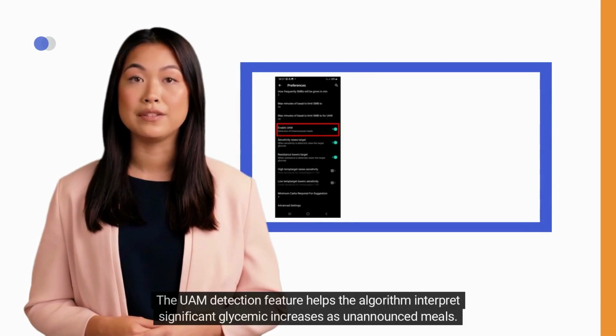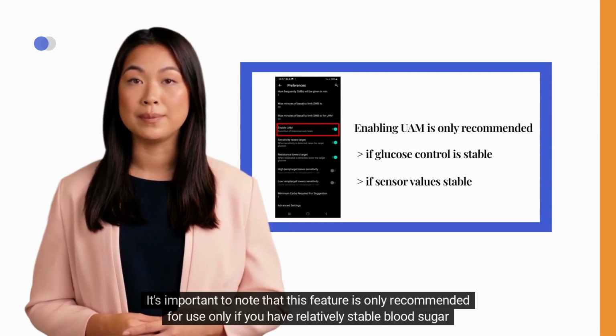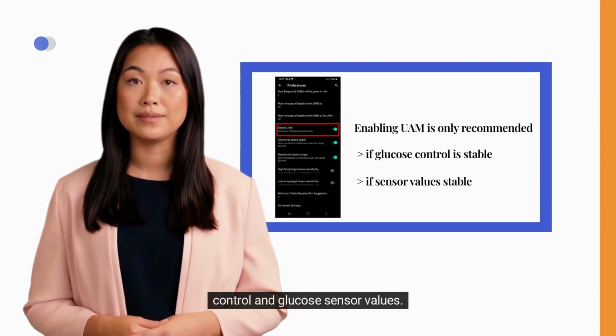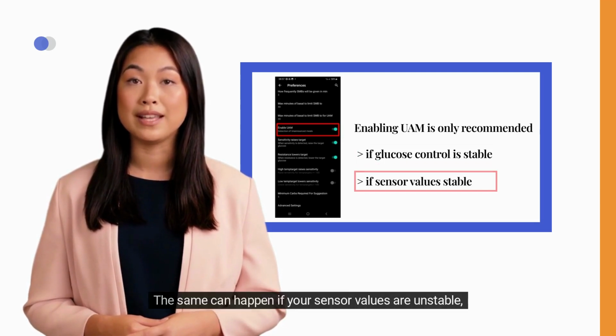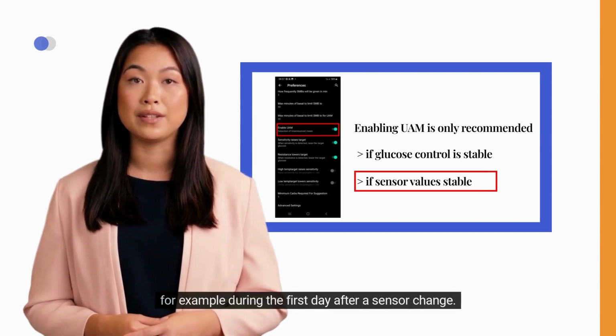The UAM detection feature helps the algorithm interpret significant glycemic increases as unannounced meals. It's important to note that this feature is only recommended if you have relatively stable blood sugar control and glucose sensor values. If your glucose control is poor, activating UAM may introduce additional variability. The same can happen if your sensor values are unstable, for example during the first day after a sensor change.